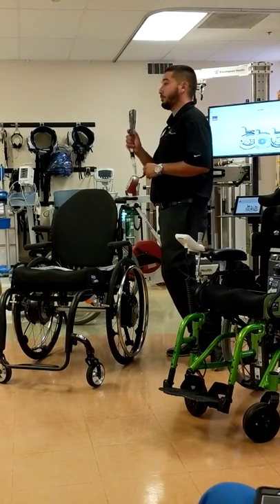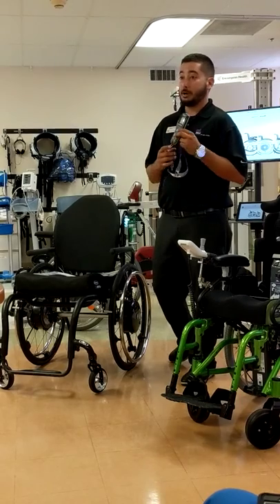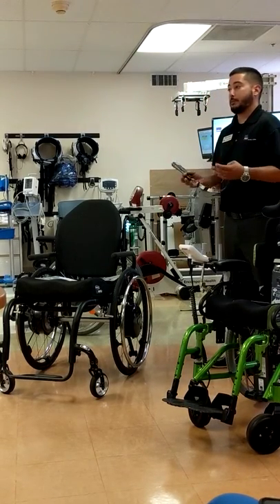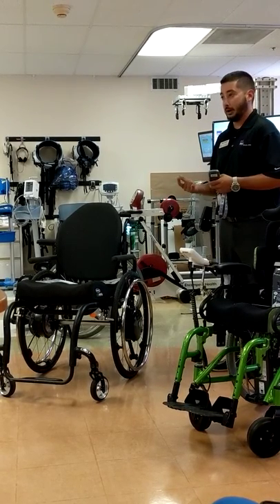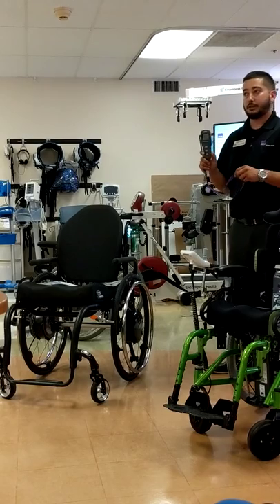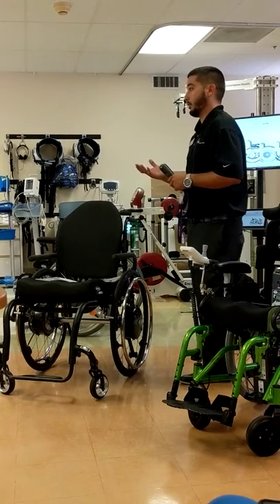With E-motion, we can program each wheel independent of each other, as well as two separate modes. You can have an indoor mode and an outdoor mode. We can program each wheel independently for sensitivity, how much power, how long the power stays on, and the reaction time when you give it a command. So if you have a user that's stronger on one side than the other, you can accommodate through programming to get them tracking straight while they're self-propelling.